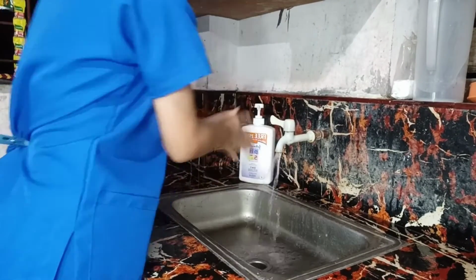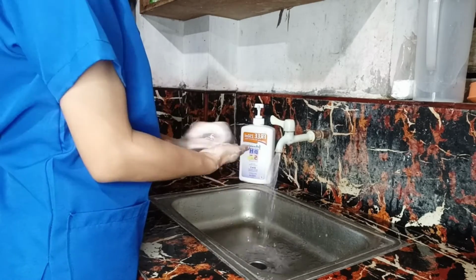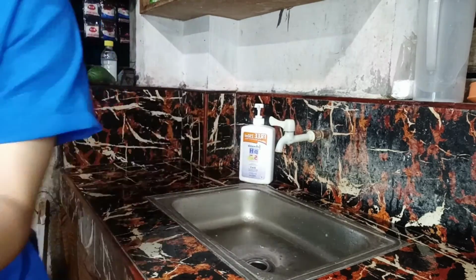First, we need to perform hand hygiene and observe other appropriate infection control procedures. So, let's perform hand washing. Then, prepare the medication from the vial for drug withdrawal.